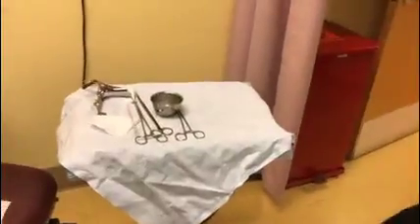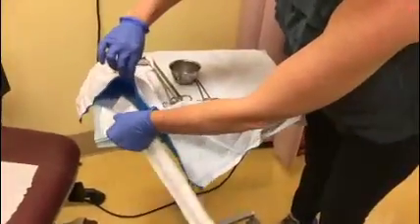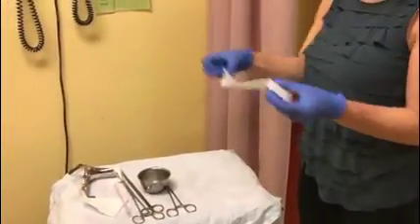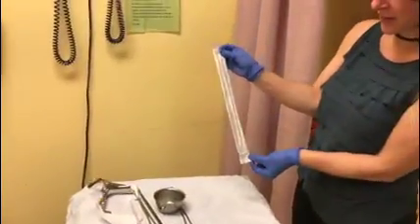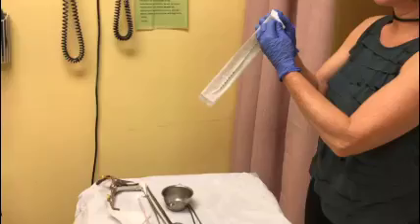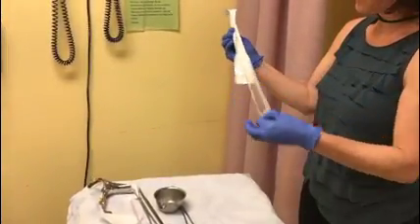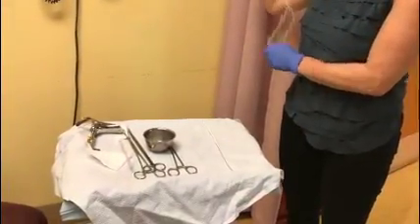The last two pieces: I have the syringe with lidocaine that I place just underneath the drape, and then I have the sound dilator, which is the last thing I open onto the sterile part of my tray. I have to be very careful that the packaging doesn't touch the tray — I open it up, hold it with the packaging on the outside, and very carefully drop it onto the sterile part of my tray.